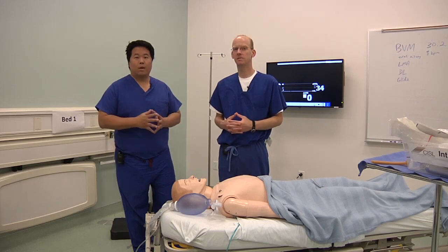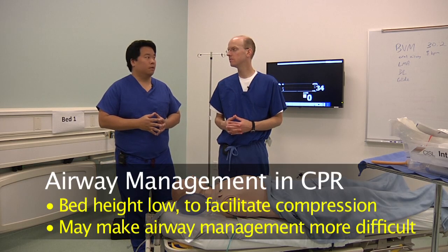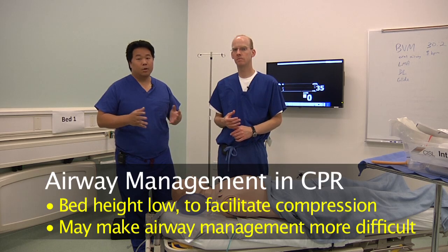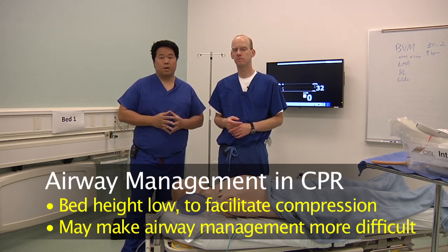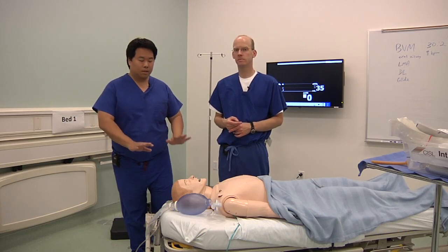So now we have the bed set up for optimizing conditions for the compressor during a cardiac arrest situation. As you can see, the bed position is markedly different than the previous situation where we tried to optimize everything for airway management. And as you can see, the bed's much lower.